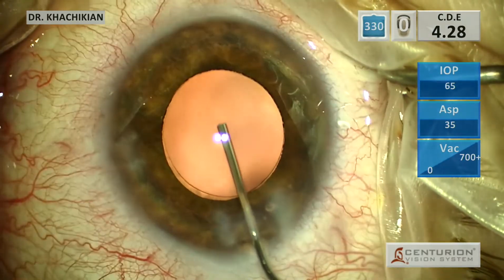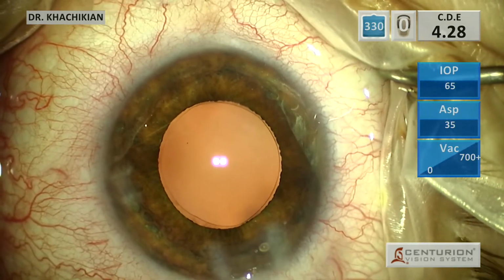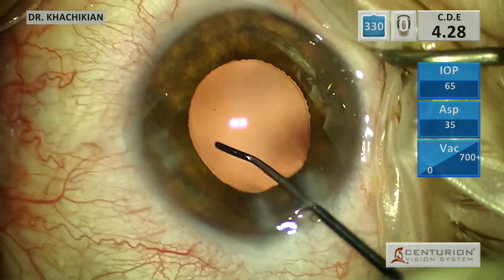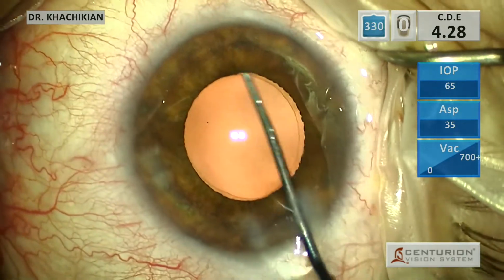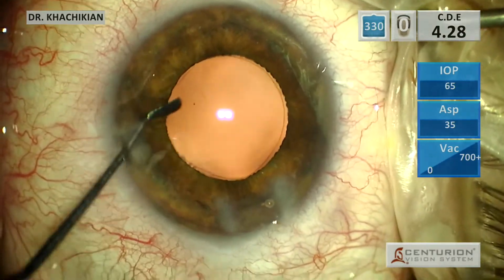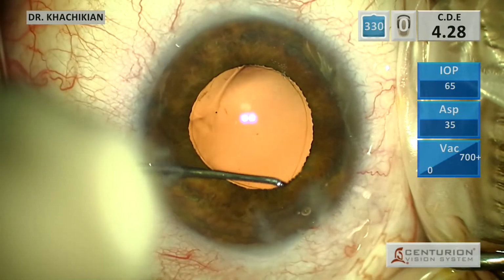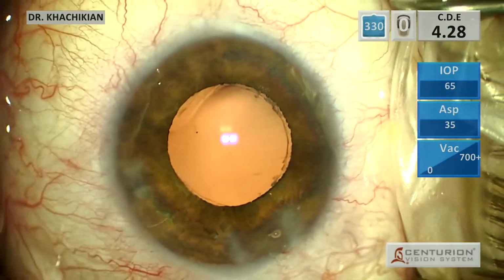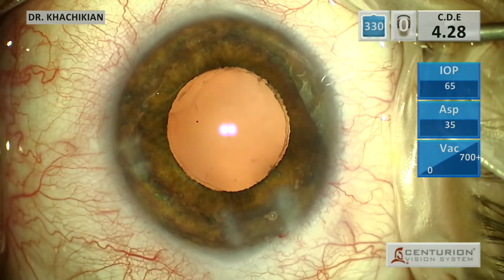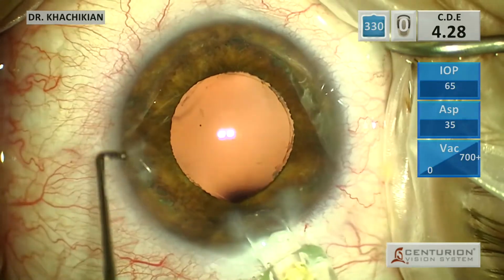And usually I will polish that anterior capsule with a sweeper. In cases like this where you can barely see the edge of the anterior capsule given the size of the pupil, I don't always do it, or I do it very gently. I don't really want to liberate a lot of iris pigment, but just remove that little remaining lens material from the anterior capsule. Usually there's a significant amount that comes off, more than you'd expect. Then we place the lens.